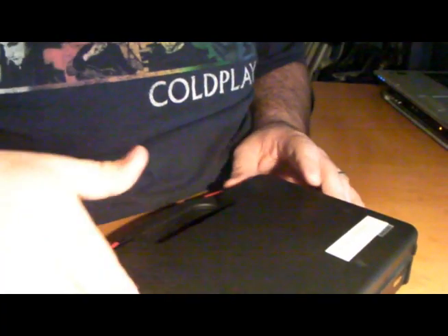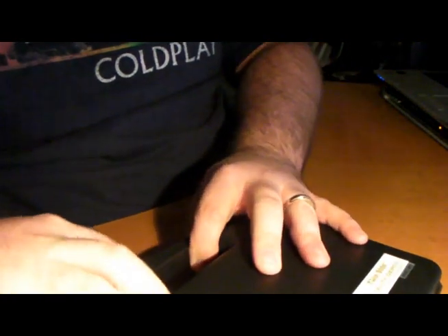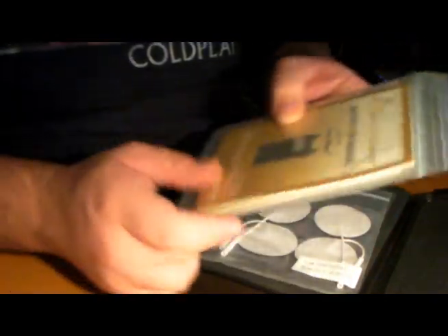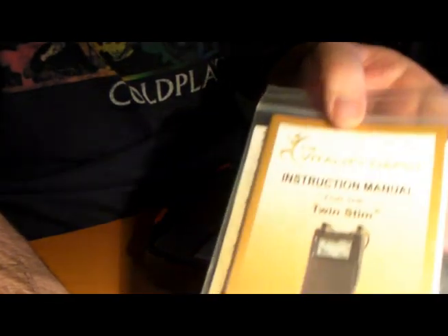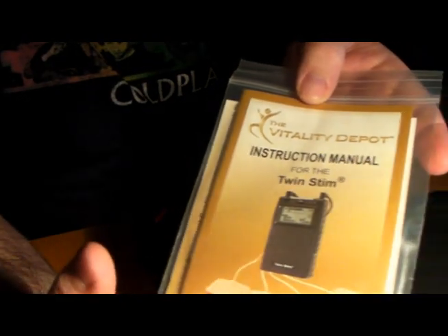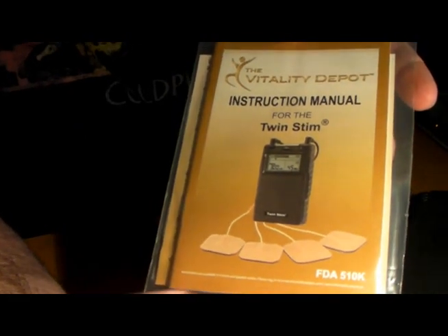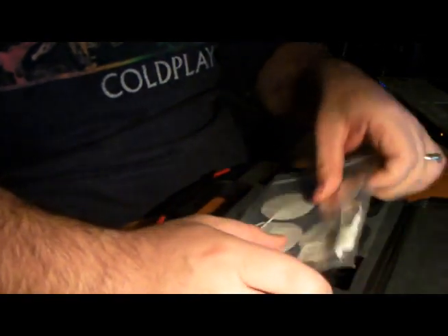I'm going to go ahead and show you guys what this is all about and angle the camera so you can see the unit. Here's the instruction manual that it comes with, and it comes with some pads in there as well. What you do is take those little pads and just stick them to the places where you broke your leg or your arm or where you're in a lot of pain. Here are some of the extra pads it comes with.